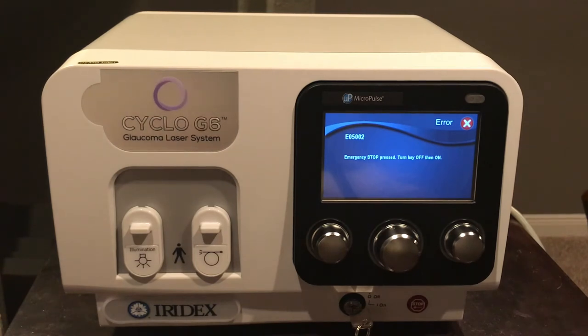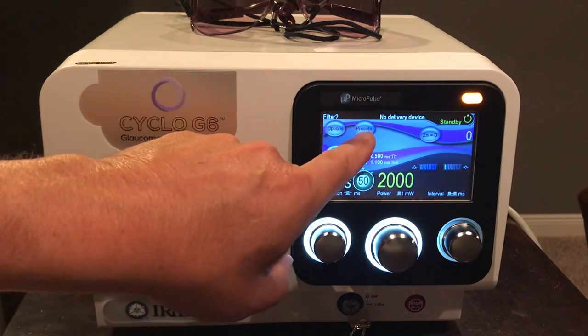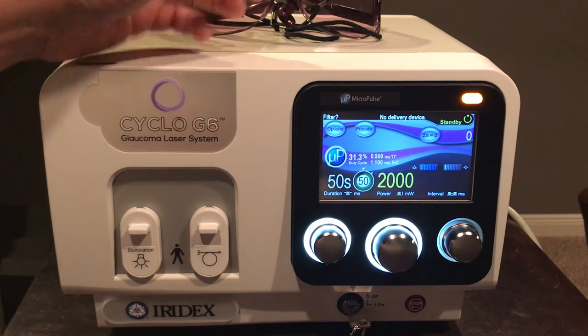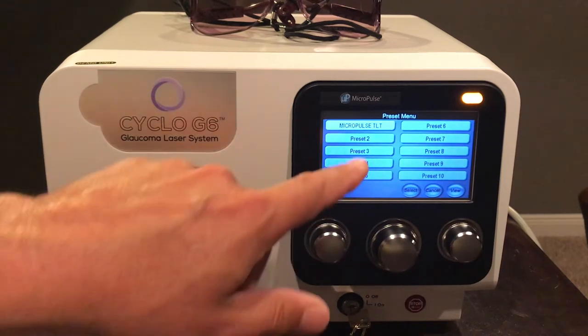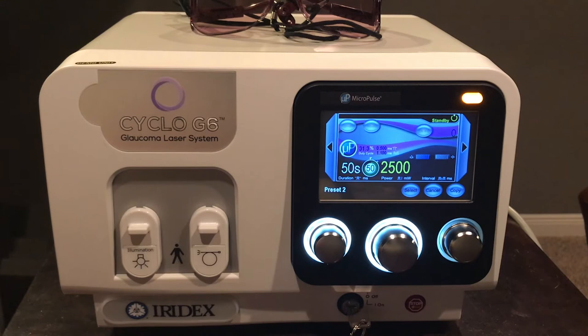The preset button allows Iridex representatives to store preset settings of power and duration for different types of treatments for different physicians. By pushing the preset button, you can view available presets — for example, one set here for micropulse TLT. You can also add a surgeon or change a preset. Pressing view shows the current mode, whether micropulse or continuous wave, depending on what you want to preset.